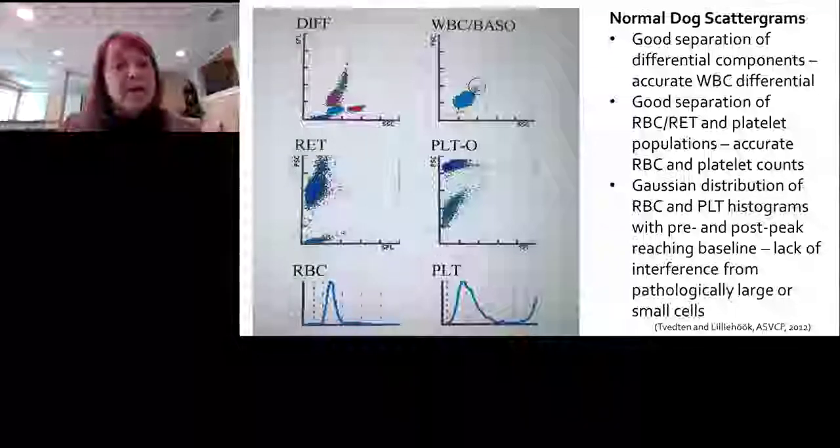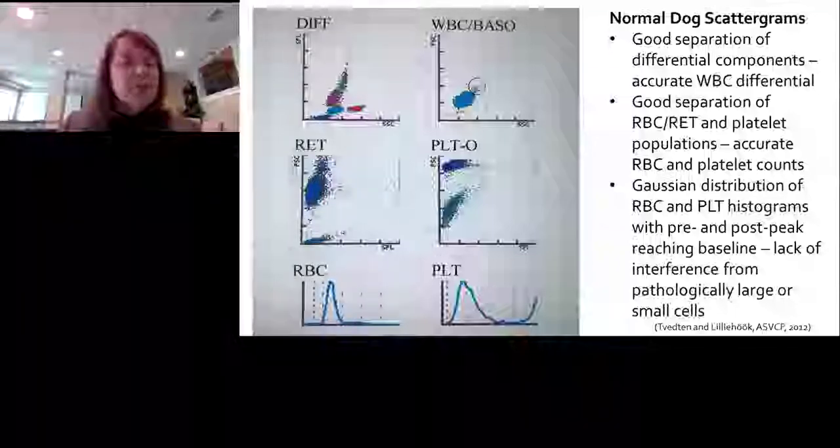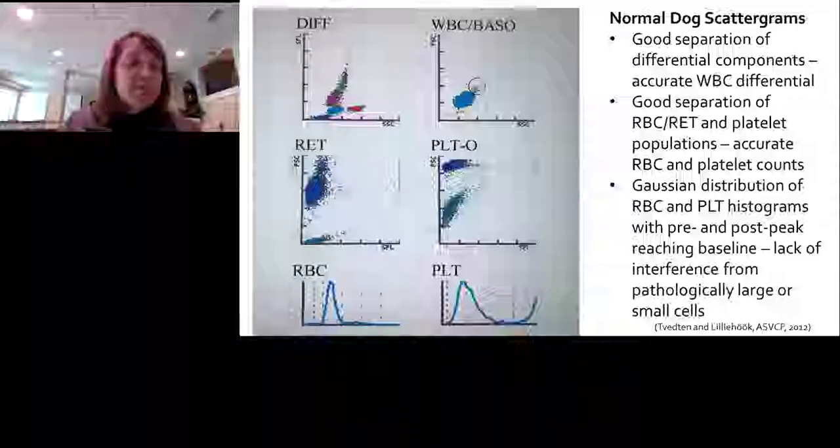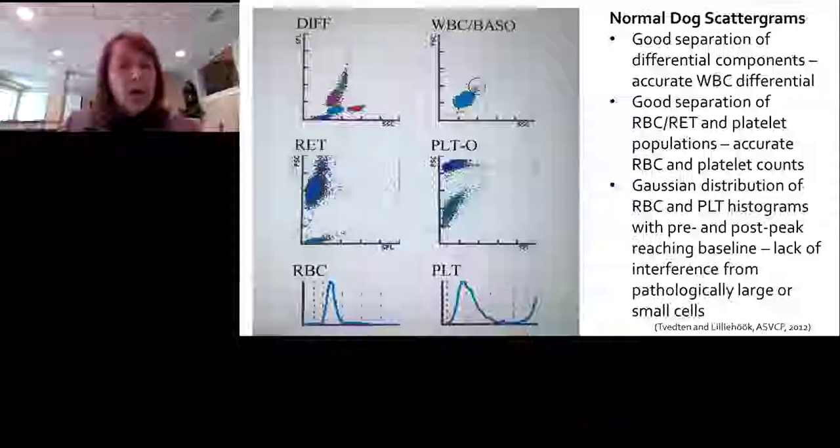So it provides us what we call a red cell distribution width, and it provides us an SD or a CV of these, and the larger our statistics, the larger the distribution. So again, it becomes a trigger for us to look at what could be causing a greater variation in either red cell or platelet size.